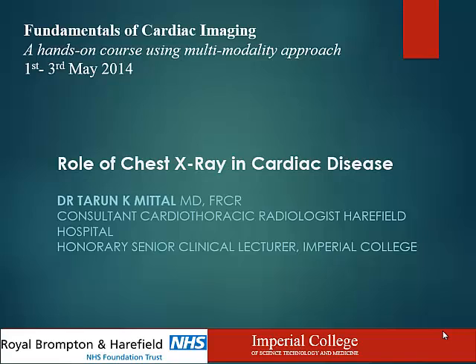Look at the role of chest X-ray in cardiac disease. Strange, isn't it? Dr. Fox didn't speak about chest X-ray in his talk, did he? Do you think it's important? Yeah? You think it's important? How many of you think chest X-ray is important for a cardiac patient?